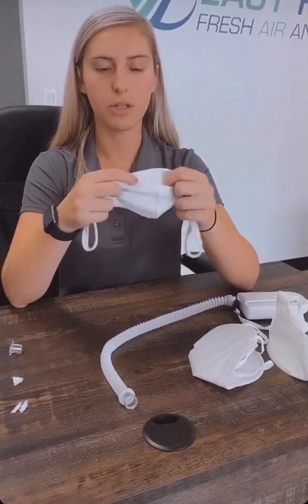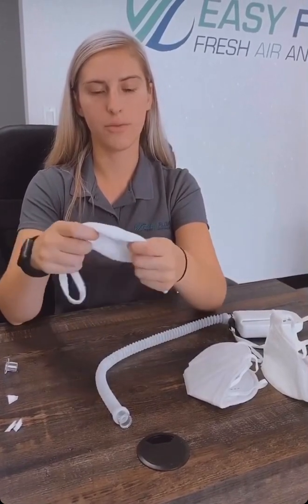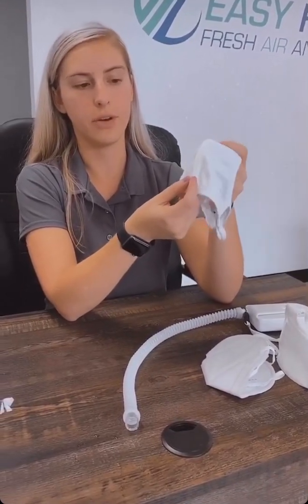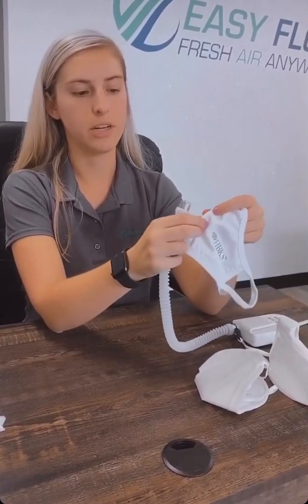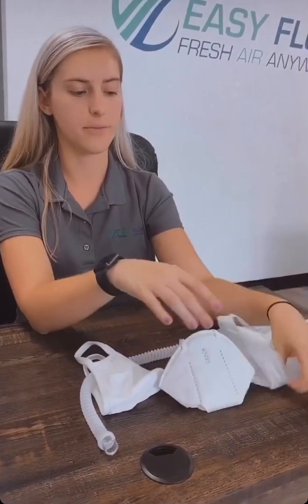And this being, most people wear a design on their mask, they don't want to cut a hole in it. And also, this mask doesn't have a strong enough frame because this cotton mask doesn't have a really tight frame on the material. You don't really want to cut a hole in this one, because with the hose, if it pulls on it, the material is going to start to fray, and it's not going to create that tight seal that you would have with the integrity of a KN95 or N95.